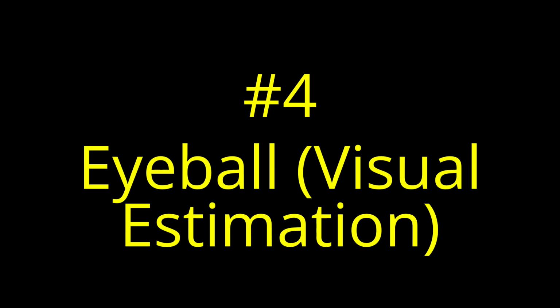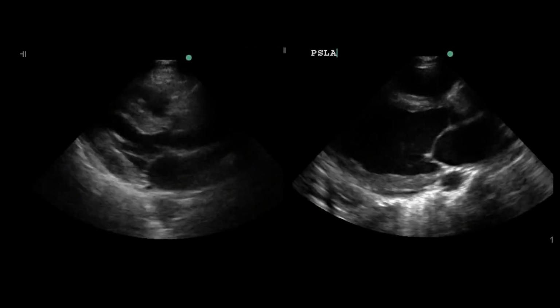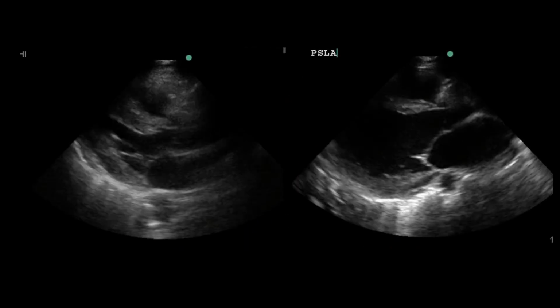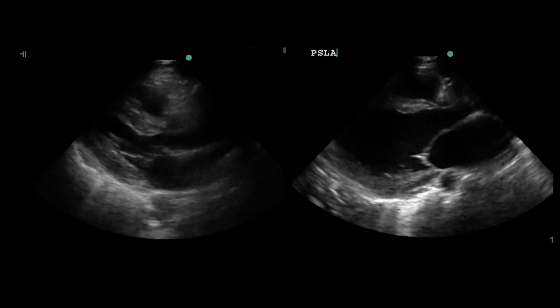The fourth and final way to measure left ventricular ejection fraction is not quantitative but qualitative. It's the eyeball technique or visual estimation. And what's happening here is that your brain is using what you know from fractional shortening, MAPSE, and EPSS and coming to an estimate of the ejection fraction. So here are two examples. Without making any M-mode measurements, which ejection fraction do you think is normal and which one is reduced?